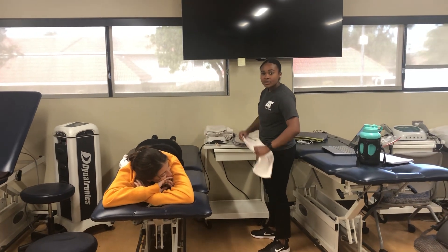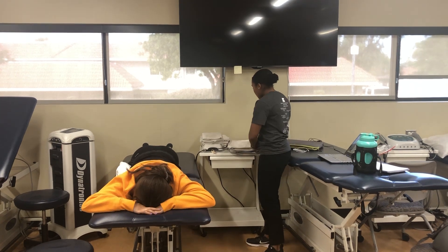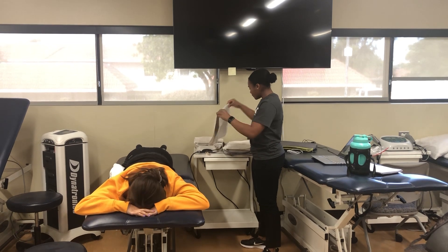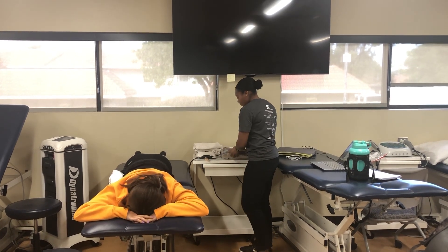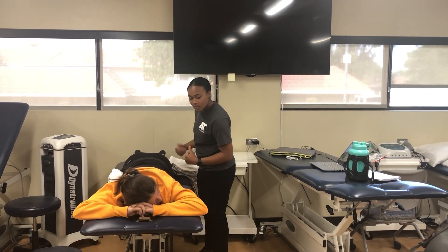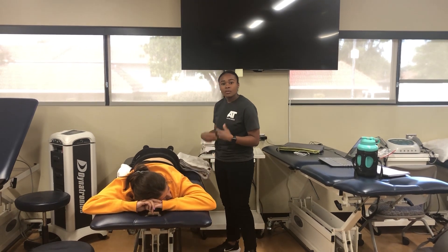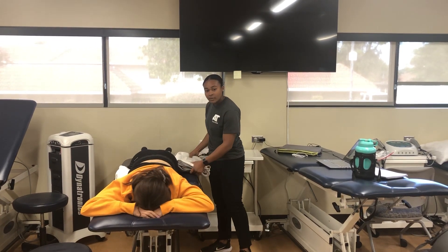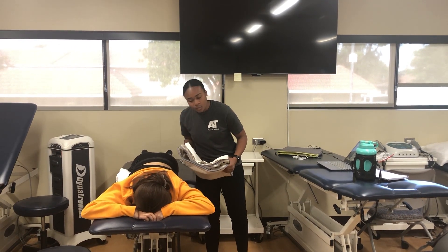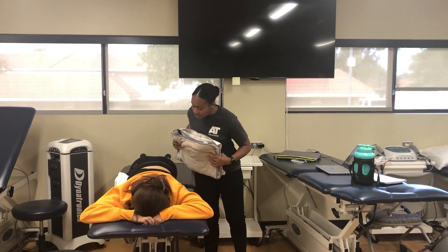Before applying the hot pack to the patient's lower back, make sure to layer it appropriately with five to six layers of towels. After getting patient consent to roll up the shirt, the patient is positioned prone with a pillow placed underneath their stomach for comfort. Before applying, inspect the back for any open wounds, scars, or swelling — none of which are present here.